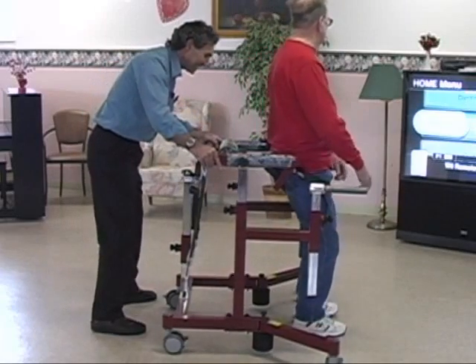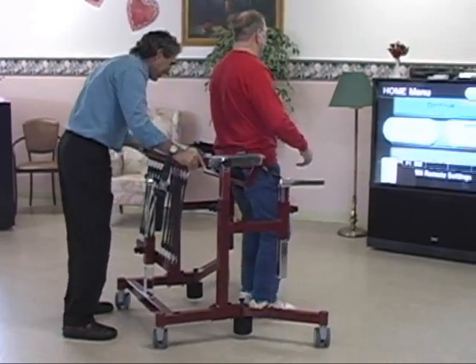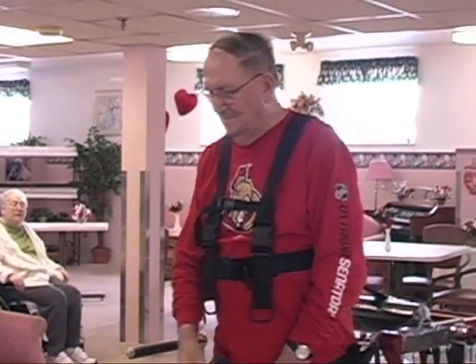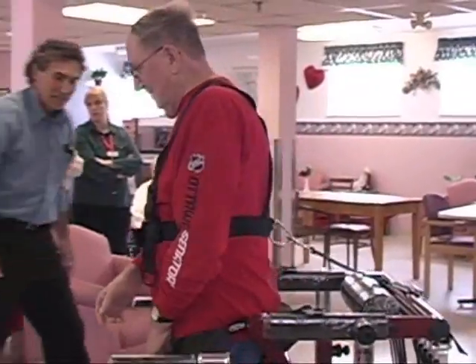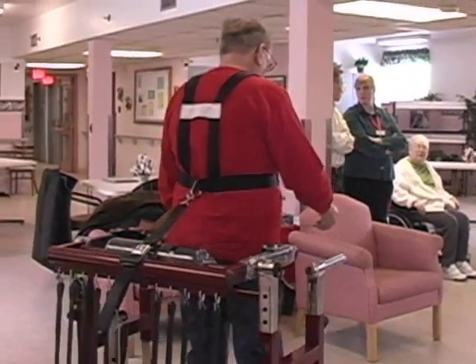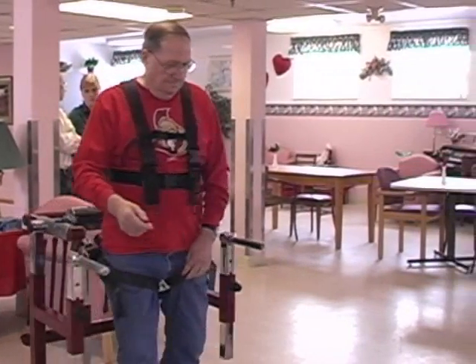The Bungie Mobility Trainer is an innovative, cutting-edge mobility and rehabilitation tool. It enables the practice of tasks needed to improve a person's impaired static and dynamic stability, mobility, weight-bearing ability and overall independence during activities of daily living.